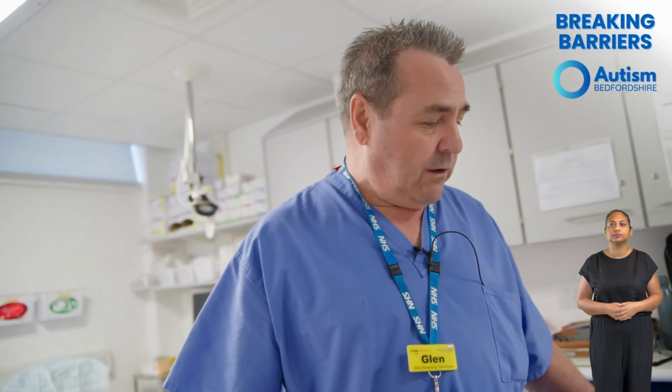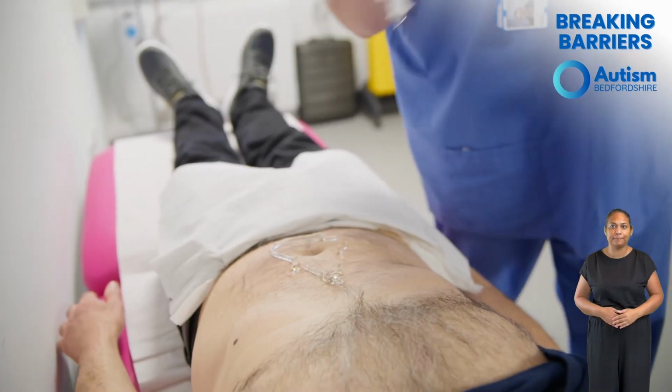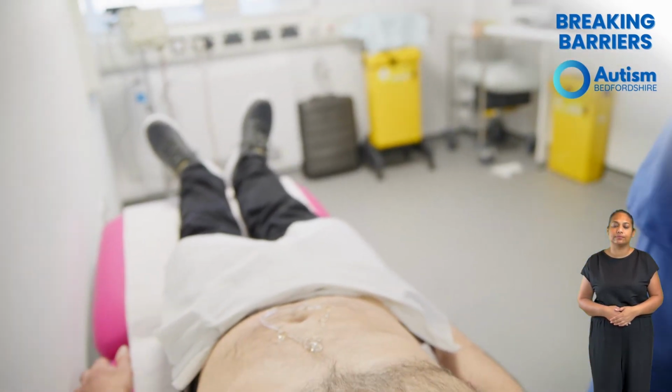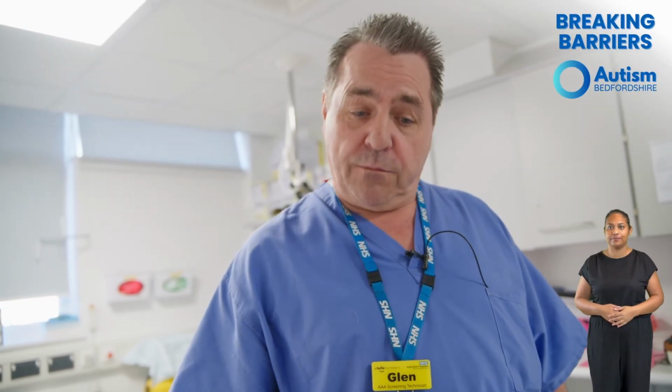Right, I'm just now going to put a little bit of gel on your tummy. It may be a little chilly. The gel may feel sticky when you're being screened. Now, if you can keep your tummy as soft and relaxed as possible whilst I do the scan, it just helps me get better images and I won't have to press down too hard on your tummy. Okay?